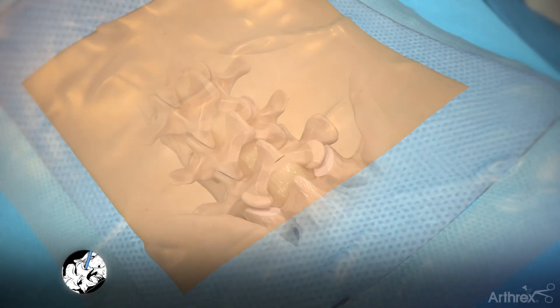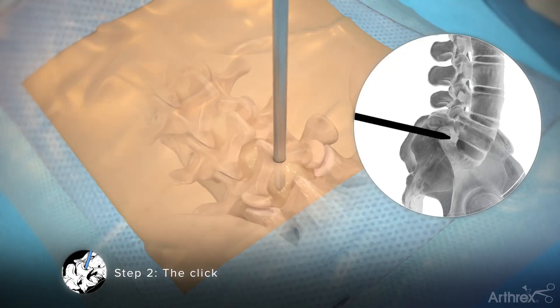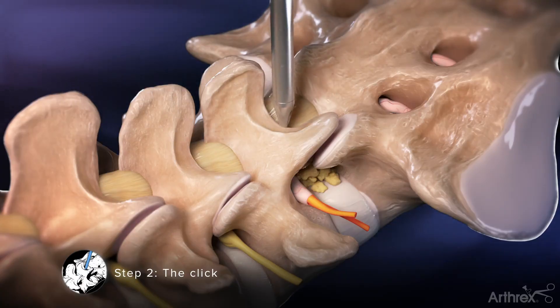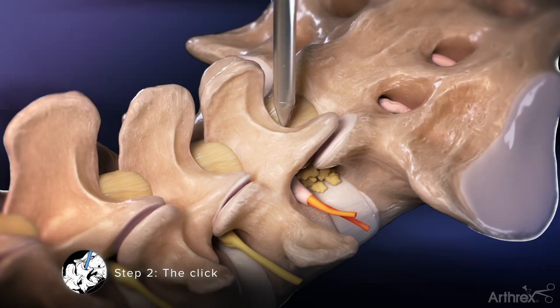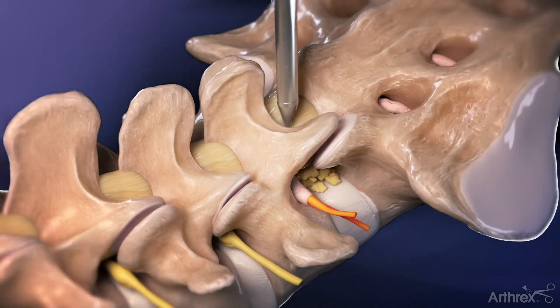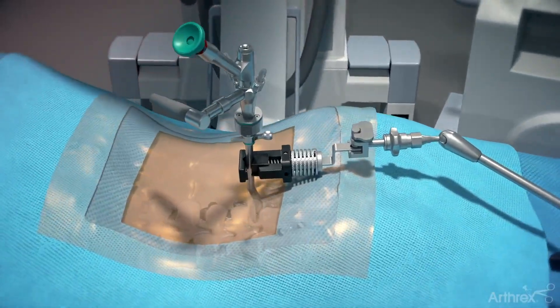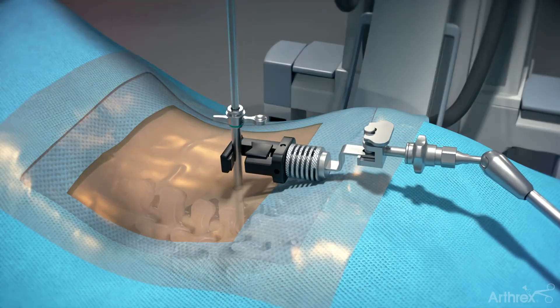Step 2: The Click. Use fluoroscopy and insert the switching stick into the interlaminar window and on top of the ligamentum flavum. The tip of the switching stick is used to traverse the inferior edge of the lamina in a caudal to cranial direction. This action should create a tactile click as the tip of the switching stick comes over the edge of the lamina. Insert the cannula over the switching stick, then remove the switching stick and insert the endoscope. The surgeon may choose to connect the cannula holder to aid in maintaining the trajectory — connect the holder to the cannula prior to the switching stick being removed.